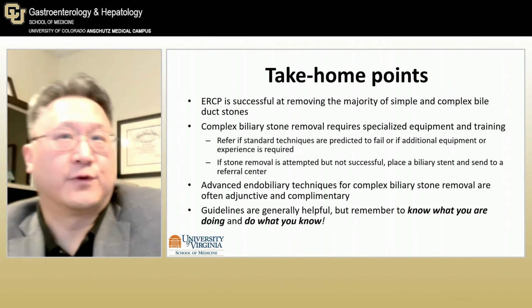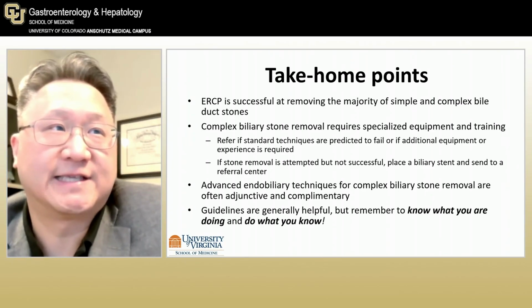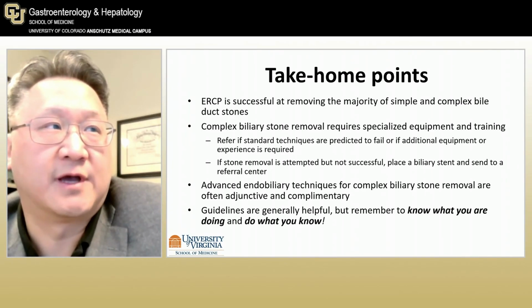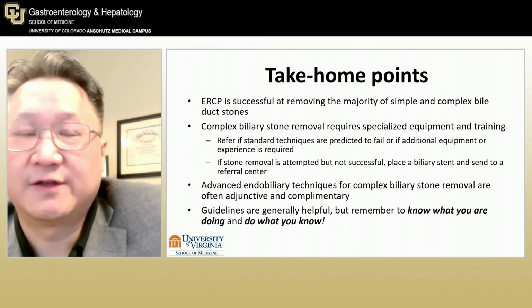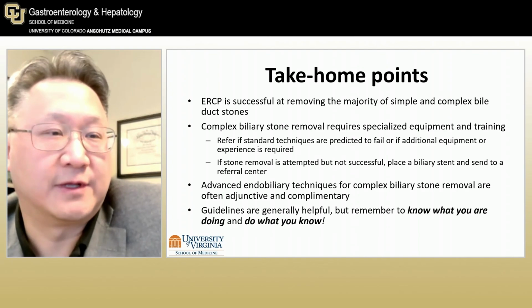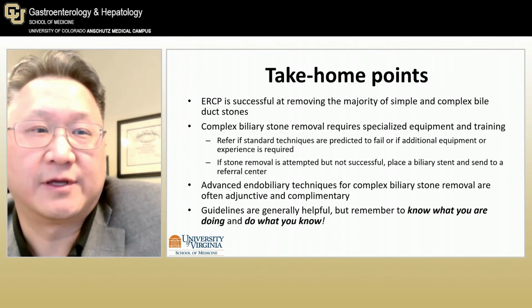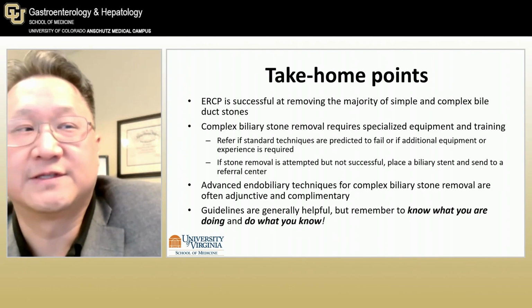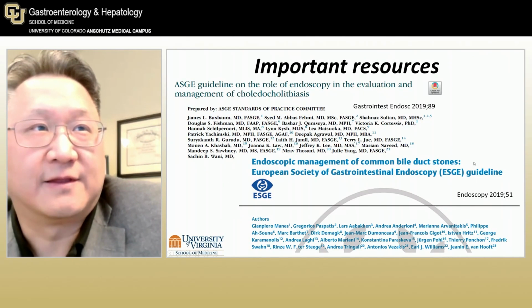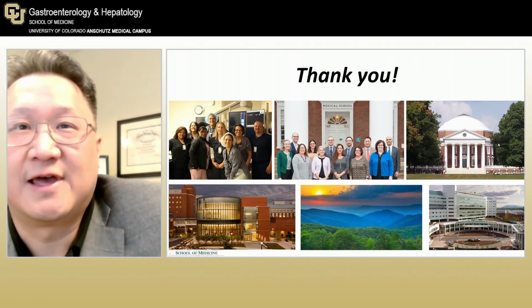So I'm not going to go through the take-home points because I'm out of time, but overall, ERCP is successful at removing the majority of simple and complex stones. Advanced endobiliary techniques often are adjunctive and can be used in tandem and in sequence. Overall, guidelines are helpful, but remember, you should really know what you're doing and really focus on doing what you know. These are the two resources that I've been quoting throughout my talk, and I'll direct you to them. Thank you for your time and attention.